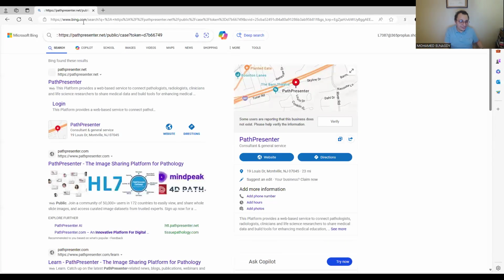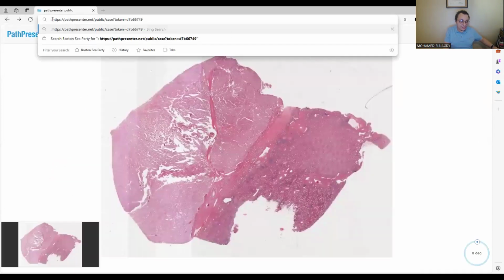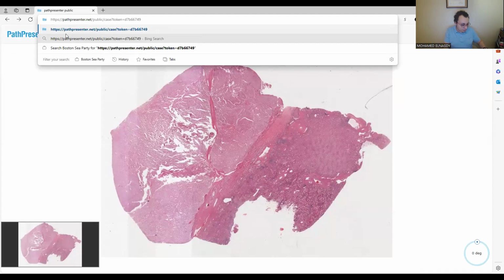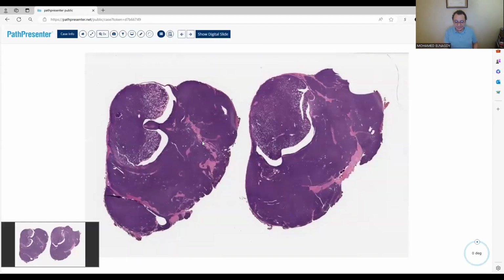Oh, okay. No mistake. I can guess the mutation from now, even without looking. See, I'm telling you, when you see the picture, you change your mind. This is actually, I would say, a low power diagnosis. Well, it's going to be BRAF from now, but let's see. It's BRAF, yeah, that's correct.